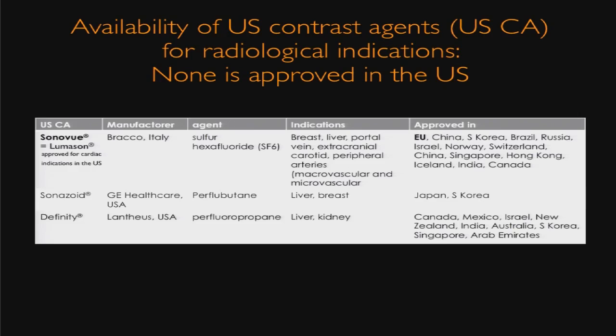You know that in Europe and in most Asian countries there is at least one contrast agent approved, and we now have Lumason, which is called Sonovue outside the US, but it is approved here in the US only for the left heart, so not for abdominal studies.